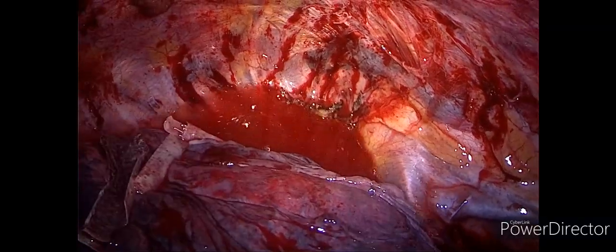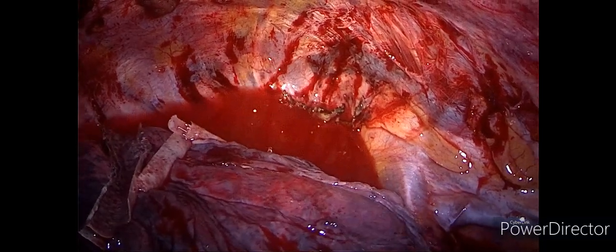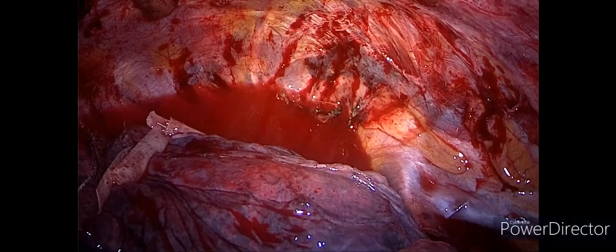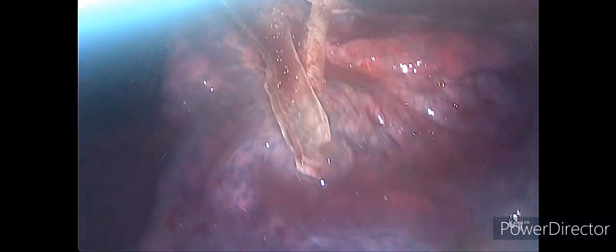And that concluded the procedure. Now we're checking for air leak by doing a saline air test. We irrigate the whole cavity with a lot of saline and immerse the resection margins under the water and check for major or minor leaks. Of course, like I mentioned, these peristrips are excellent pneumostatic and hemostatic materials, and we're just checking for missed lung injury or any other site of air leak.